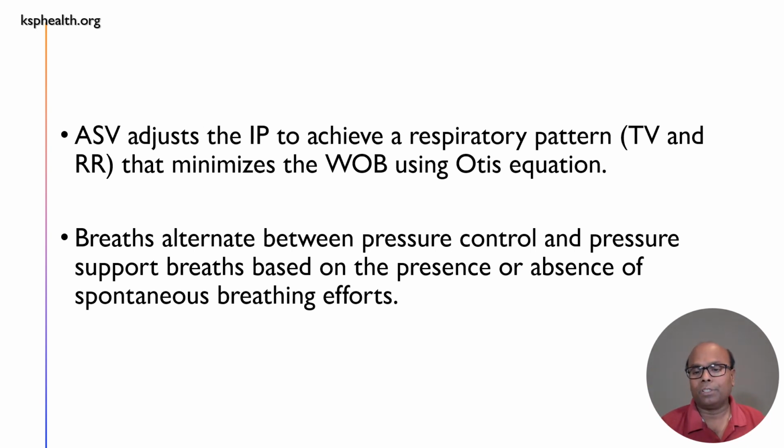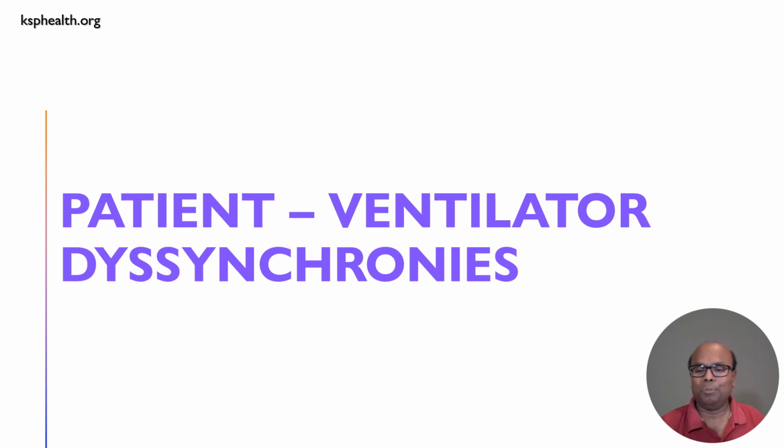And also it weans on its own. As the lung compliance improves, it decreases the pressure or volume needed to deliver the same minute ventilation. And also, as a clinician, every day you see the patient and decrease the minute ventilation required for the patient. It's an interesting mode. I love it because it removes lots of manual errors that could happen when you are dealing with sick patients. Okay, this concludes the mode section of the mechanical ventilation.